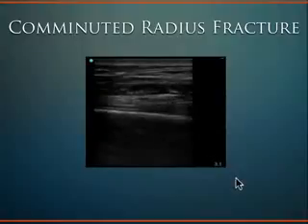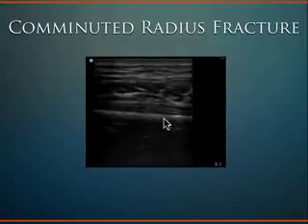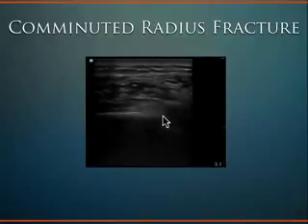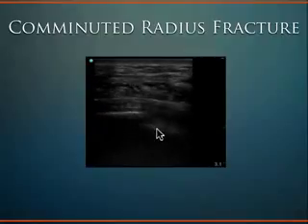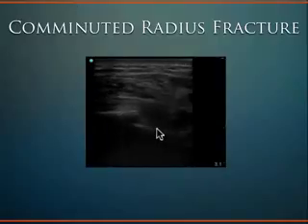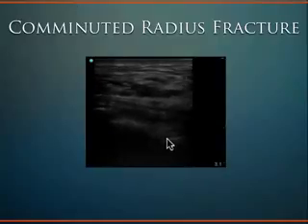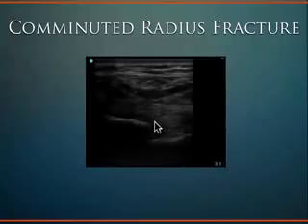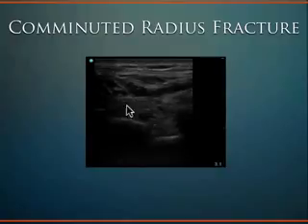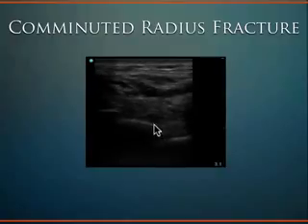This is a comminuted radius fracture. You'll see the continuity of the cortex line here, and then eventually you'll come into play here where you're shadowing step off to this cortex line here, and then as we move further along, you'll see another step off down to here. So there's basically two fracture lines, comminuted multiple fracture locations, again seen very exquisitely with the ultrasound.